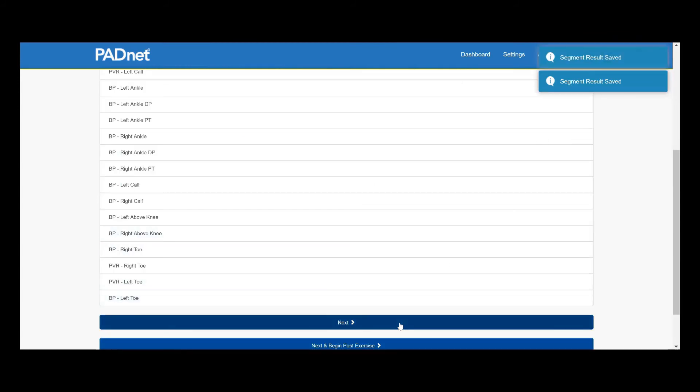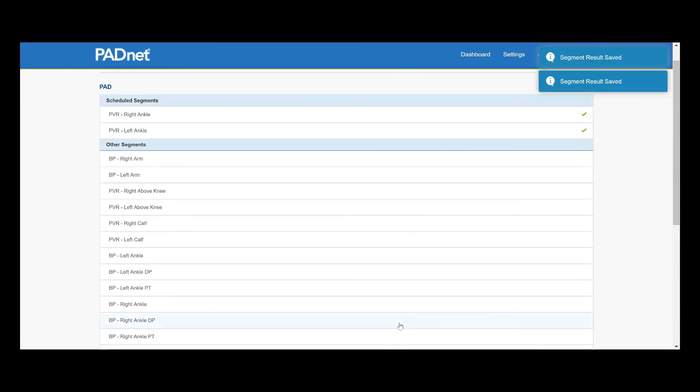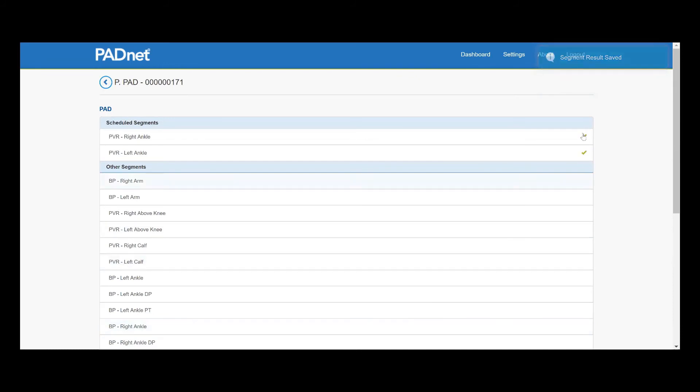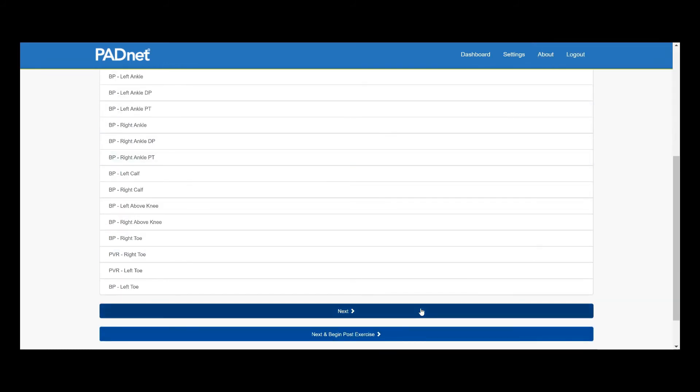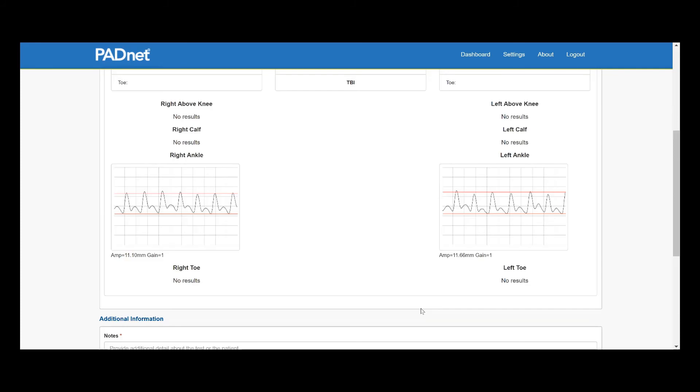If you wish to conduct the blood pressure segments, now would be the time that you do so. But all we need are our two ankle PVRs.